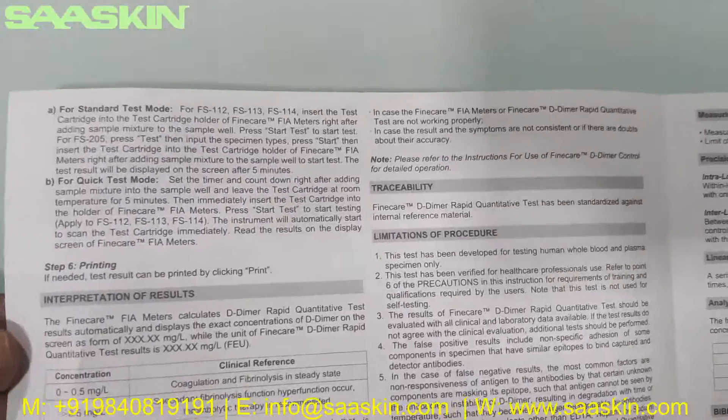The brochure contains the complete procedure, instructions for the test, and how to interpret your results. You have the complete procedure in this paper.